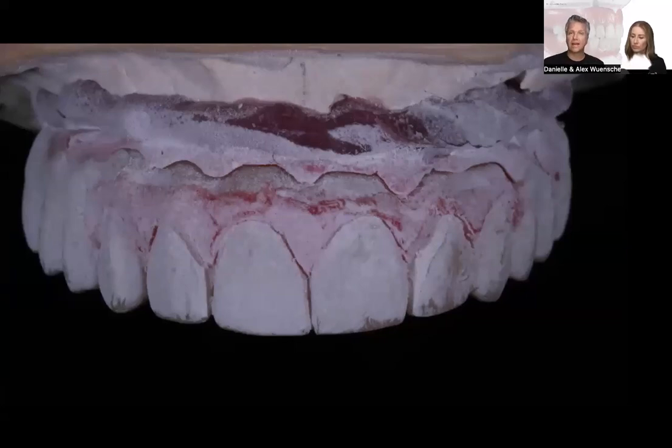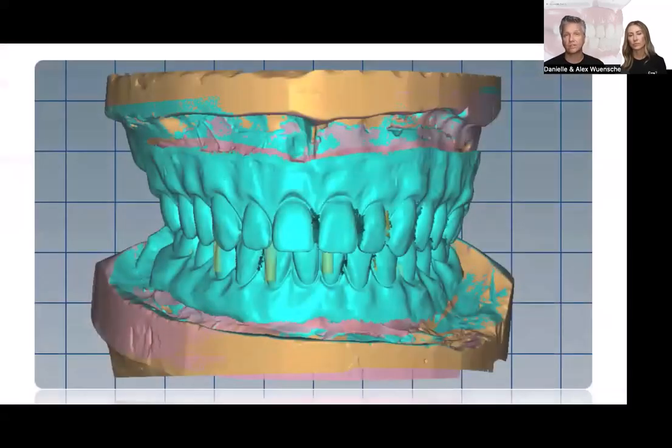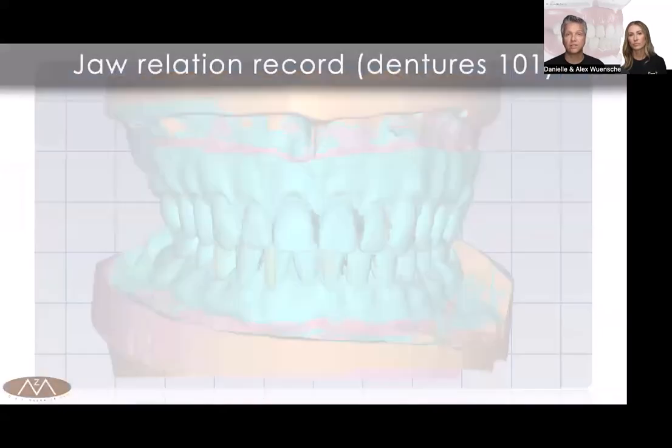You don't even realize that, basically, but we have many workflows now. We don't do analog anymore. We're actually utilizing printers and milling machines and design software to achieve certain results we want, right? So here we have the case digitized.